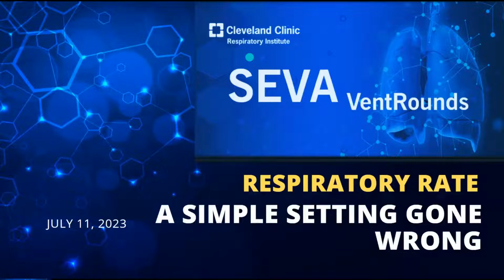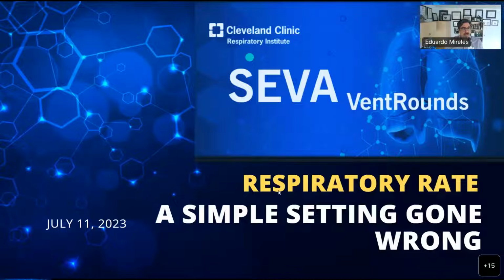And the topic for today is a little bit of respiratory rate and when a simple setting goes wrong. And we'll talk a fair amount about this.